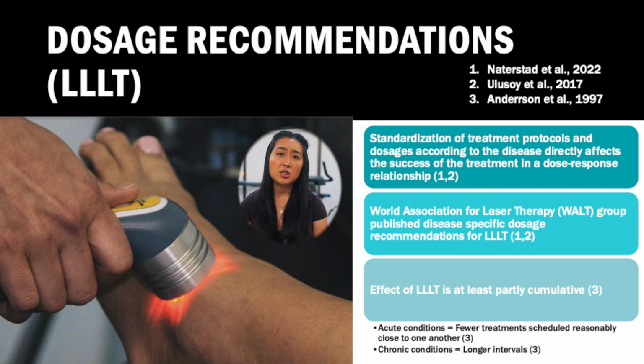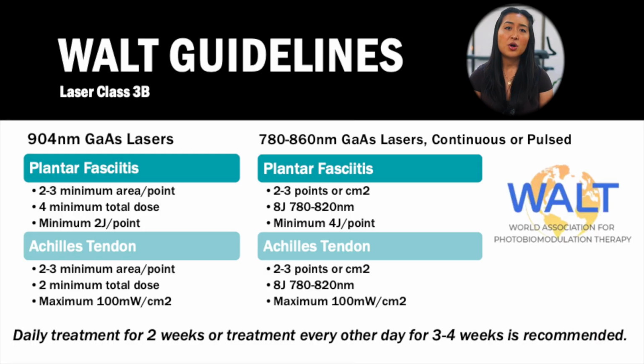The literature also suggests that the effect of laser therapy is partly cumulative. So on the next slide, we will discover that laser therapy needs to be delivered a lot more frequently than shockwave therapy for it to be effective, especially for more acute conditions. So these are the WALT guidelines. I have listed the recommendation guidelines for plantar fasciitis and Achilles tendon since we're talking about lower extremity pathologies today.